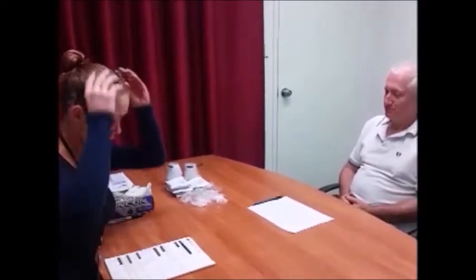Okay, so we have our first donor in for testing this morning. Michael has already presented to me his photo identification. I have accurately copied the information from his identification onto the chain of custody. Michael, have you had any medication in the last 2 weeks? No. Nothing? No vitamins, painkillers, prescription or non-prescription medication? No. Nothing? Okay.